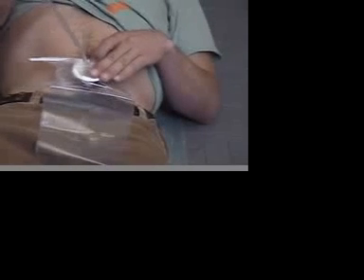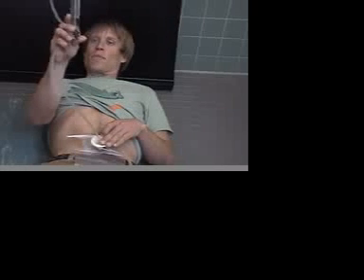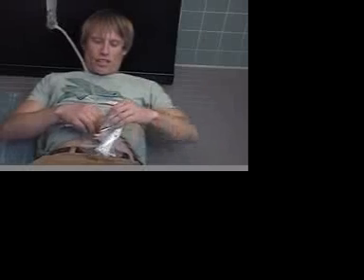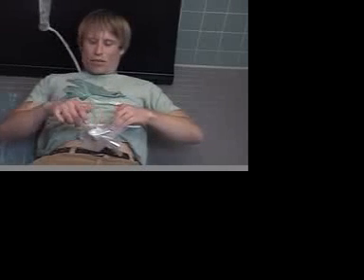All of these have a little wheel on it that will show you how fast the water is moving. You don't want the water to be moving too fast. It'll irritate your system. Slower is better. So I usually have the wheel moving at a steady pace and apply about 1 liter of water to my system. Once that's finished, I'll lift up this end. I'll keep both ends up just in case there's any water leaking out.